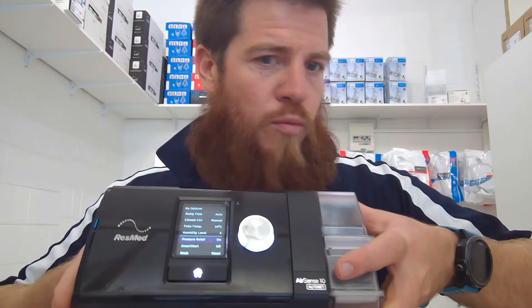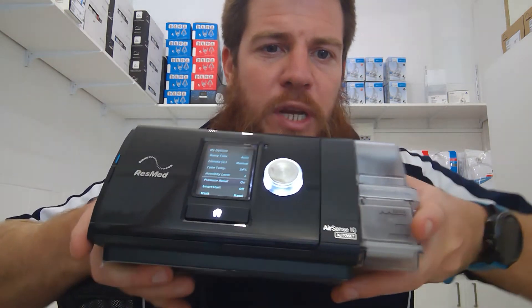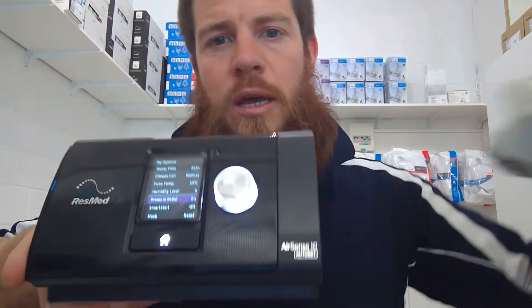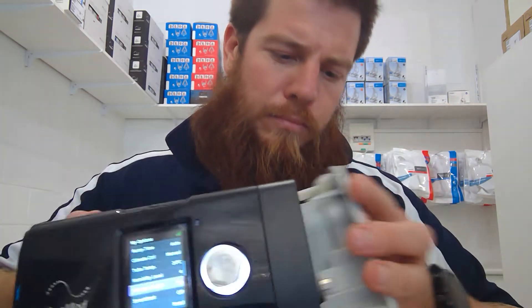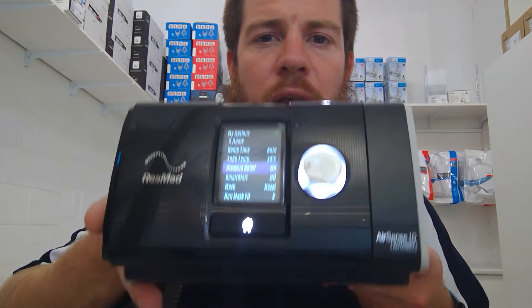With the AirSense 10, when you first buy the machine you'll get it looking like this. You can actually replace the humidifier tub with a side cover — this one's white, excuse the lack of colour coordination. That just clicks into the side of the machine. You could just turn all the settings to off within the humidifier, but this cover will automatically do that for you, and it makes the machine a bit smaller and more efficient.